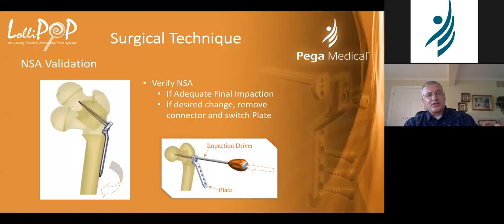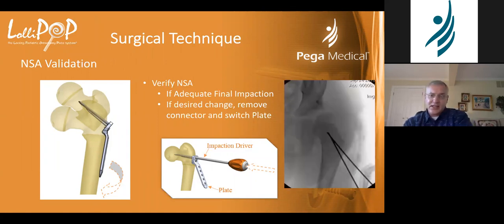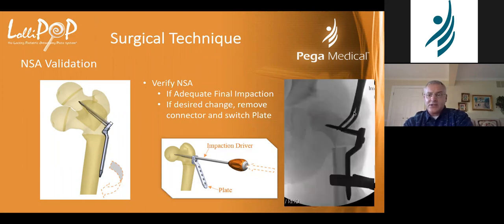So the first thing is, once you lock your plate on, you can then reduce it with a Verbrugge or your fingers. And if you look, this is another case of DDH, child getting a varus osteotomy. And you can see that I have the plate in place. I have it connected to my 110-degree blade, and this is the neck shaft angle that I have achieved. You then can check your neck shaft angle intraoperatively and see if you like it.